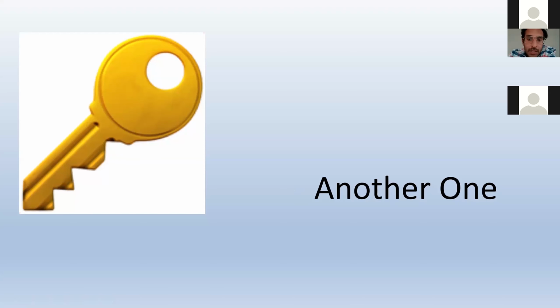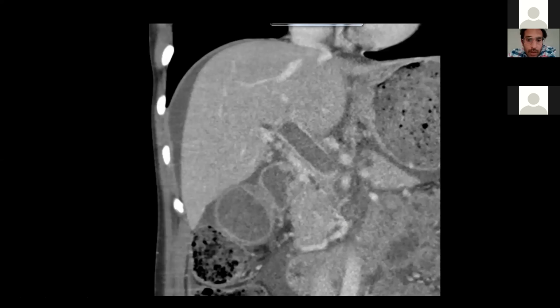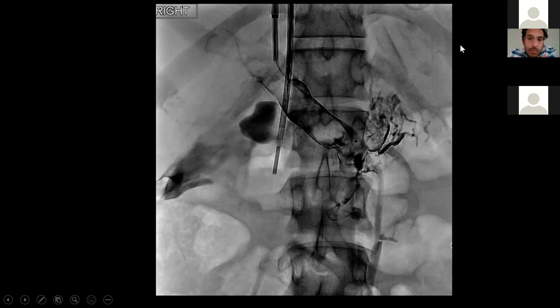And then the last case, I want to just show another for everybody that's still with us. This is a patient with acute portal vein thrombosis. Really nice picture here. I always ask people if they would go transhepatic. You can see there's ascites here. For us, what's really changed the game is being able to use ICE and single stick puncture this. And again, you can see this beautiful venogram outlining that clot.